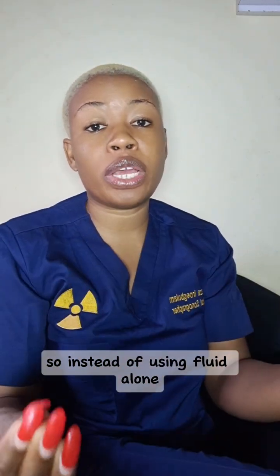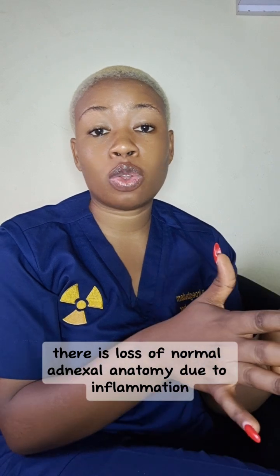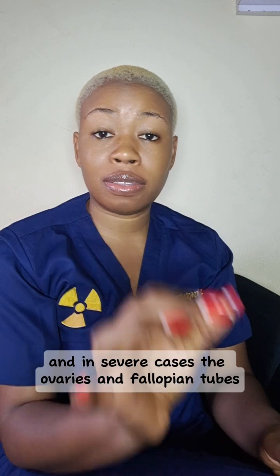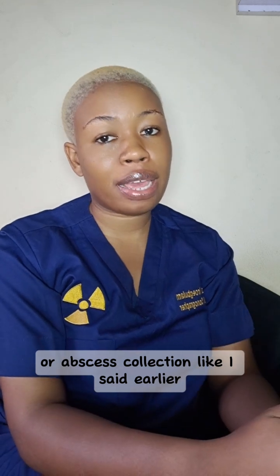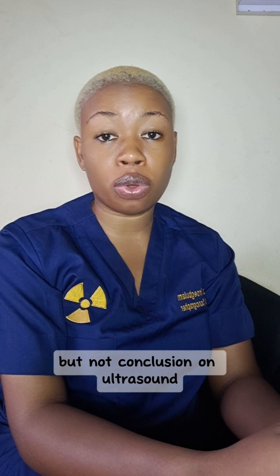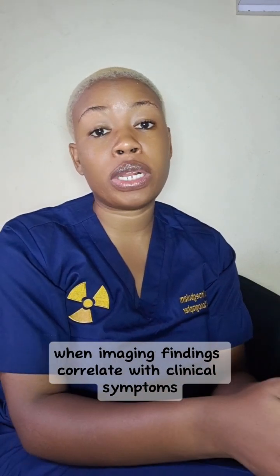So instead of using fluid alone, we look for a combination. Number 1, we look out for probe tenderness, that is, you feel pain when we apply pressure. Number 2, there is loss of normal adnexal anatomy due to inflammation that causes this hazy appearance on scan. And in severe cases, the ovaries and fallopian tubes show severe fluid collection or abscess collection. Like I said earlier, free fluid alone in the pelvis should raise suspicion, but not conclusion. On ultrasound, PID is diagnosed when imaging findings correlate with clinical symptoms and laboratory evidence.